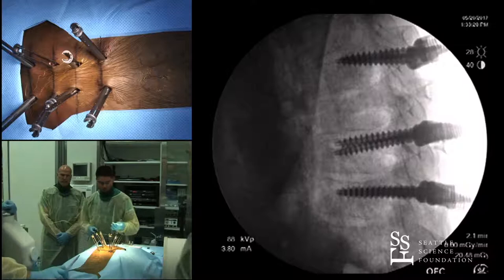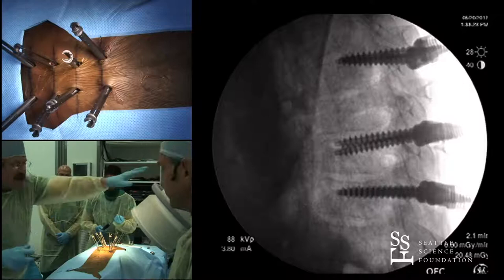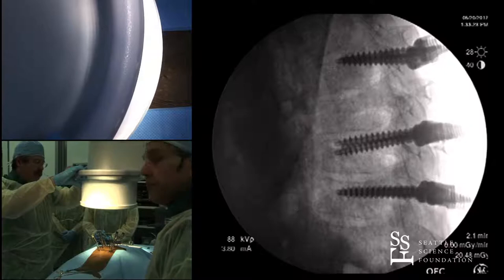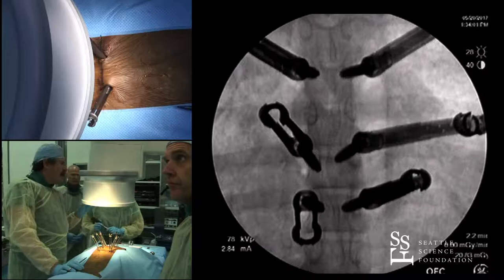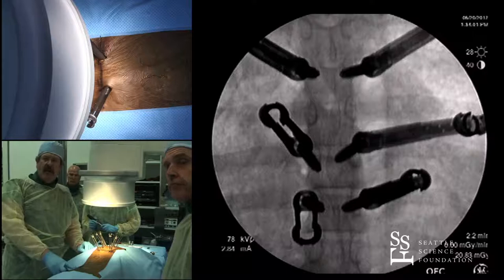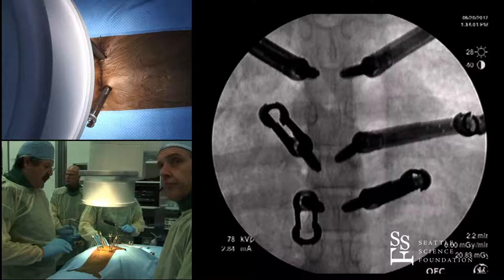We have one more set of screws. I want to show you — I have one screw that's a little bit medial. Now, if a screw is deep into the vertebral body it can actually look medial to the pedicle, but this screw I will tell you is medial because when we put it in we could see it passing medial. If you take a look at the screw on the right side of the screen: that one started about the middle of the pedicle and it crossed the medial border before hitting the back of the body — I can guarantee that one is in the canal. The others, despite being deep, are right at the medial part of the pedicle or just medial to it and are all very safe.